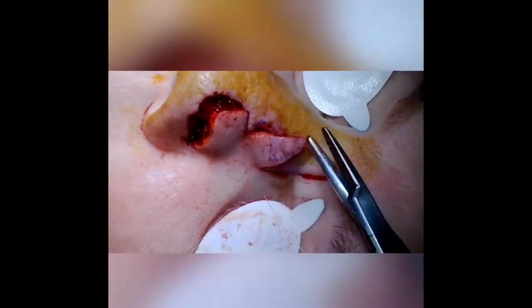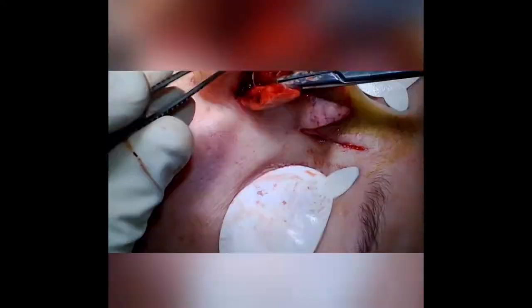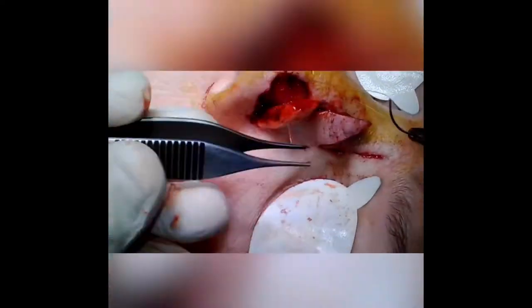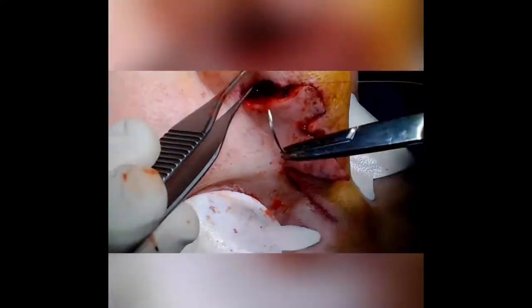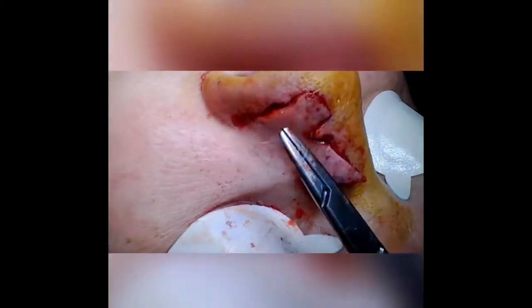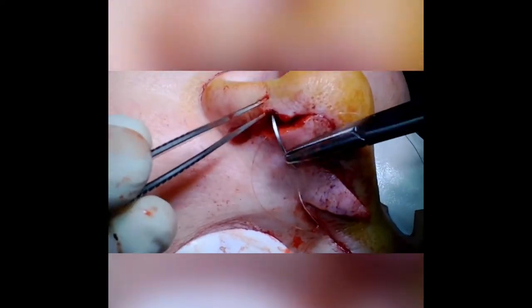Doing the deep dermal closure — once the lobes have been set it's a fairly straightforward procedure from here, just placing the deep sutures. Checking the flap, making sure you're not misaligning any of the skin edges, not over- or under-advancing any of the lobes, and not putting too much tension on anything. That's very important for the healing process.